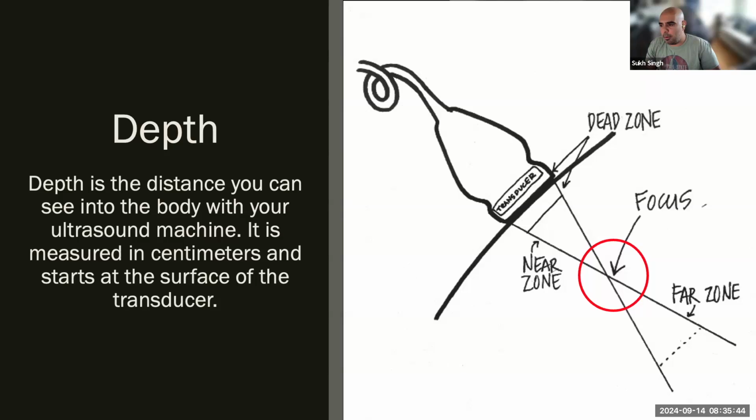The big takeaway when you're scanning is whatever you're interested in, just put in the middle of your screen.